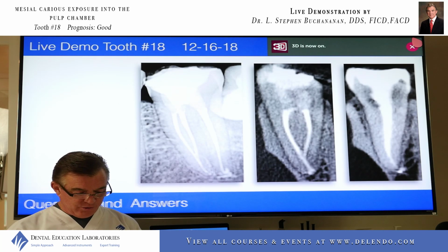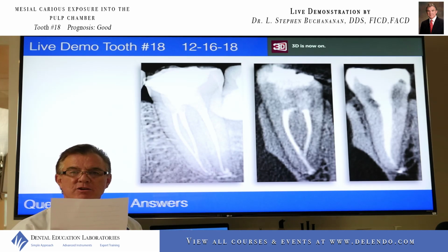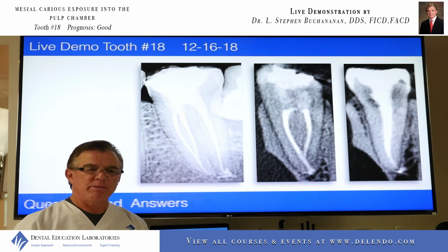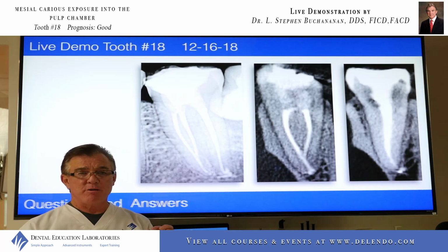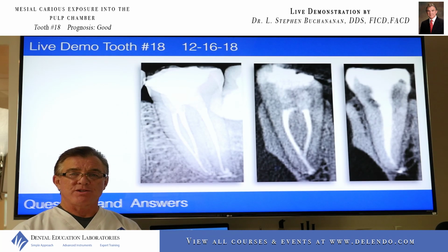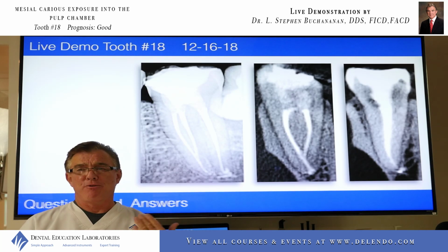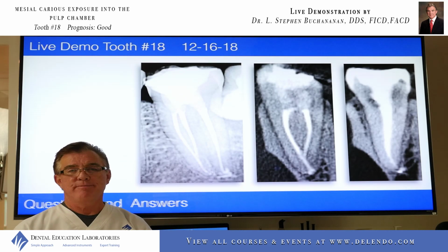With pulp canal sealer, you recommend the plugger be 4 to 6 millimeters from the terminus, but with high flow, you recommend a shorter distance. What distance would you recommend with high flow? Because high flow BC sealer doesn't shrink upon setting, we do not have to thin the sealer layer out to minimize the amount of shrinkage away from the canal wall. That was the problem we had with all conventional sealers before now. Now, because the sealer isn't going to shrink, we don't care if there's a pool of sealer, or if a lateral accessory canal or a third or fourth canal in the root is filled just with sealer. That's a great filling material. It's going to do the job.